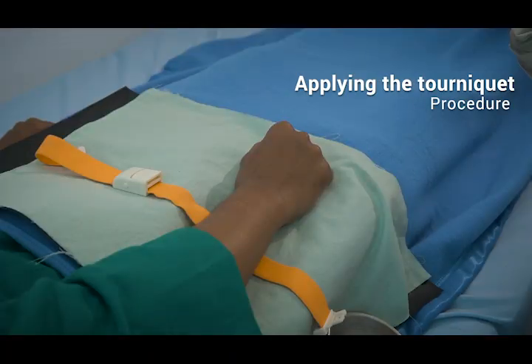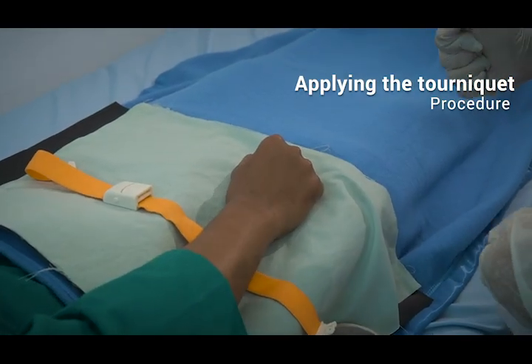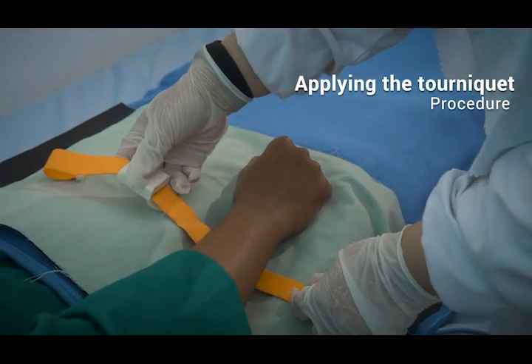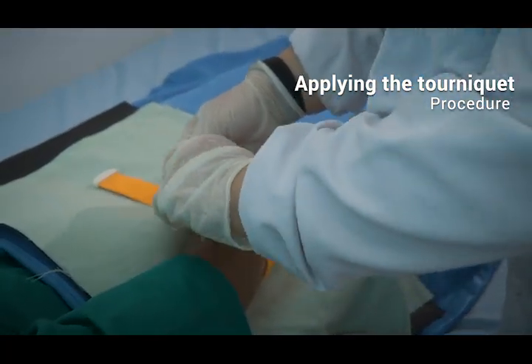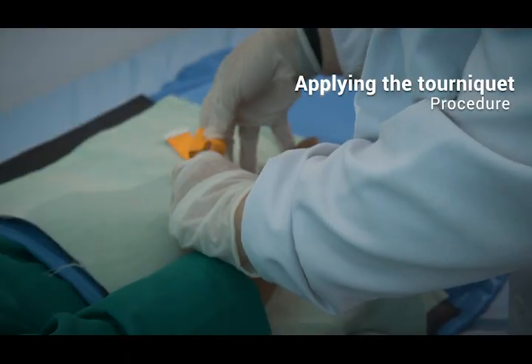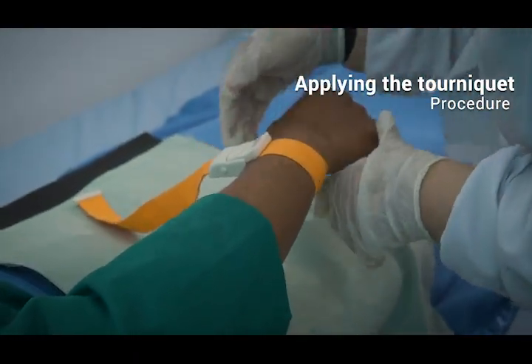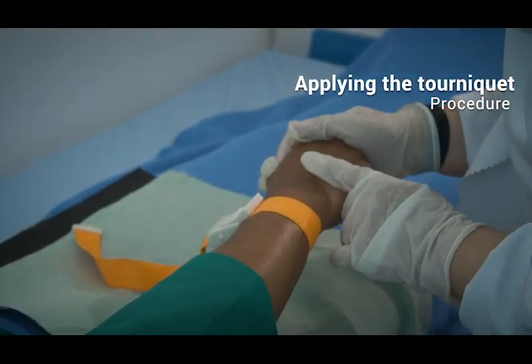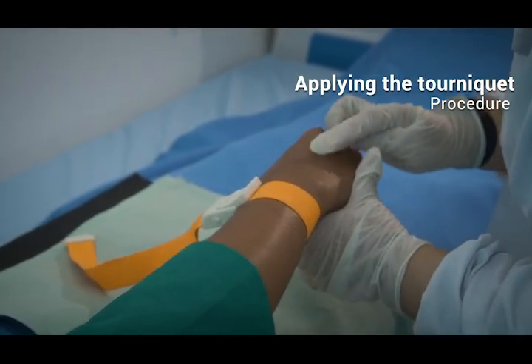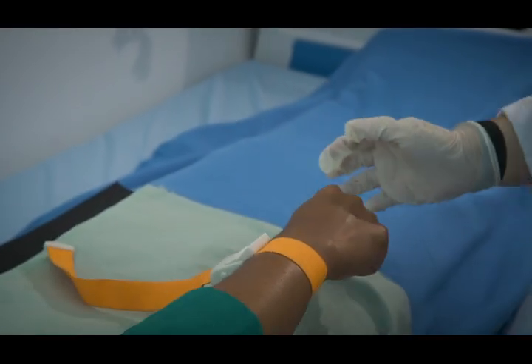Applying the tourniquet. Apply a tourniquet on an upper extremity to dilate the veins and assess for an appropriate insertion site. Apply the tourniquet loosely or avoid its use in patients who are at risk for bleeding, or have compromised circulation or fragile skin. Assess the patient's veins in the upper extremity and identify potential sites that are easily seen or palpated.